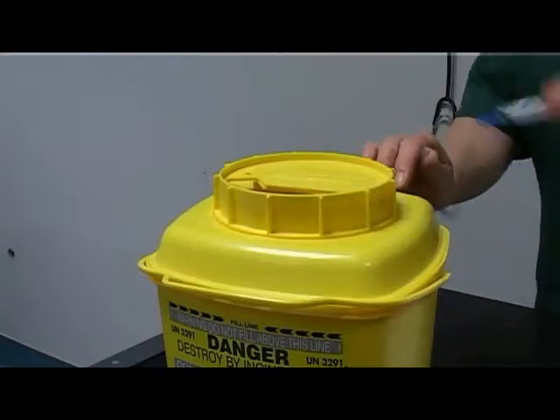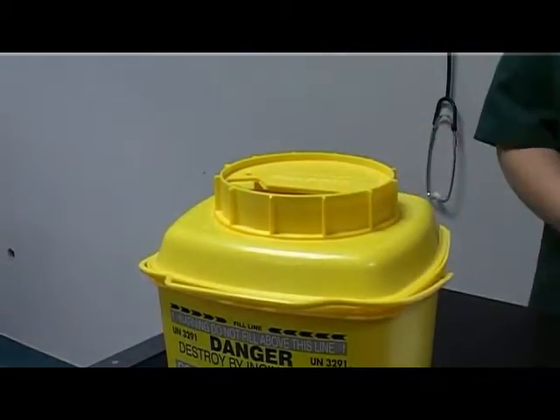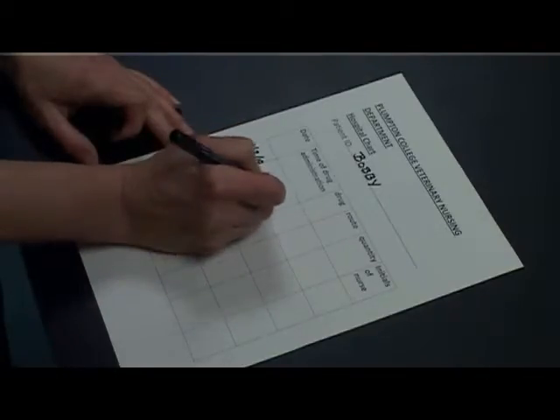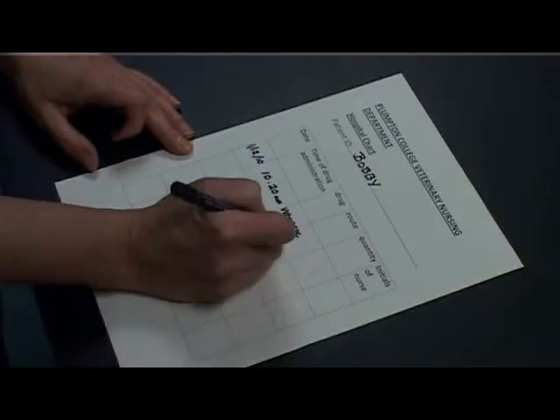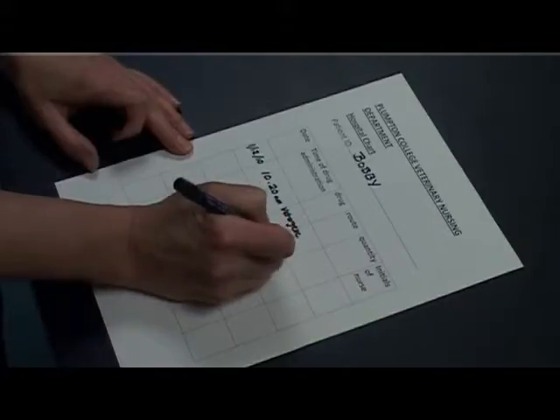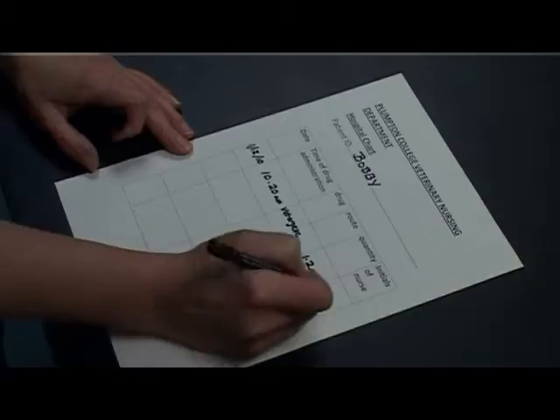Dispose of used needles in a medicinal sharps bin without re-sheathing. Dispose of the syringe in an appropriate container. Record the administration of the medication fully on a hospital chart. You have now demonstrated a safe, effective and aseptic technique.